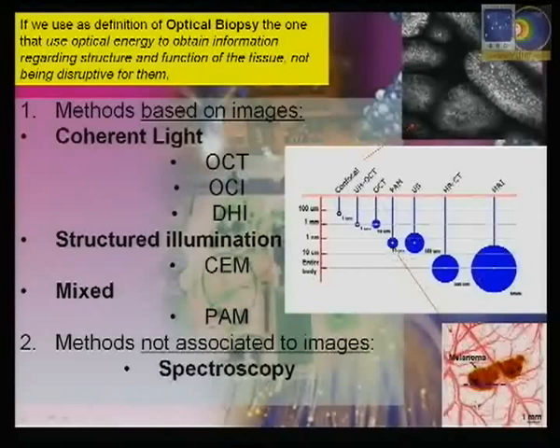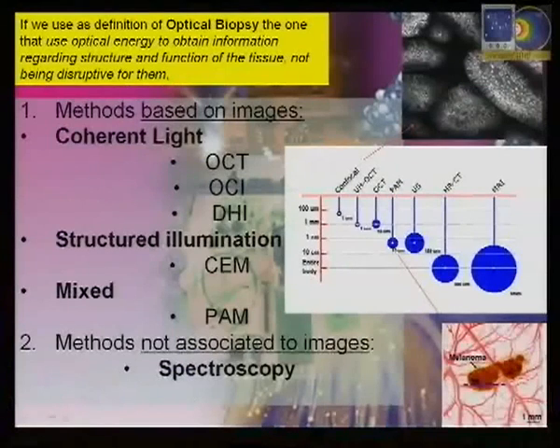This is the case of the photoacoustic microscopy that we will see later on, in which you can see on the skin, on a surface area, but deep inside, a melanoma area infiltrating the vessels which are in the subcutaneous tissue.